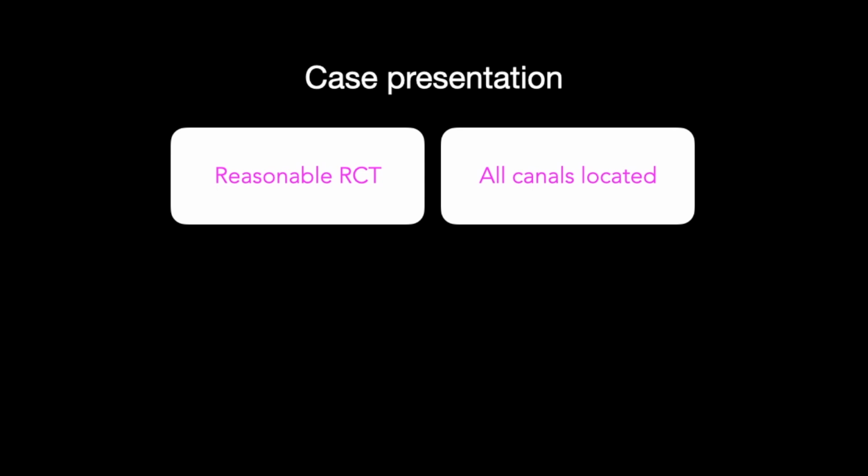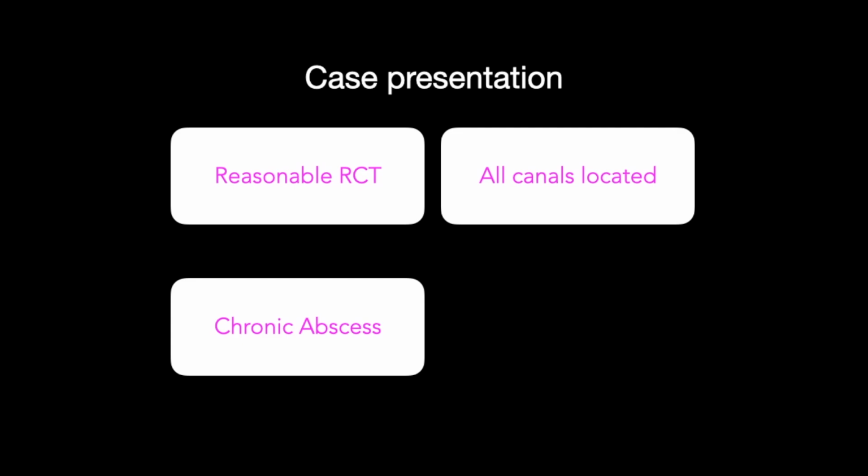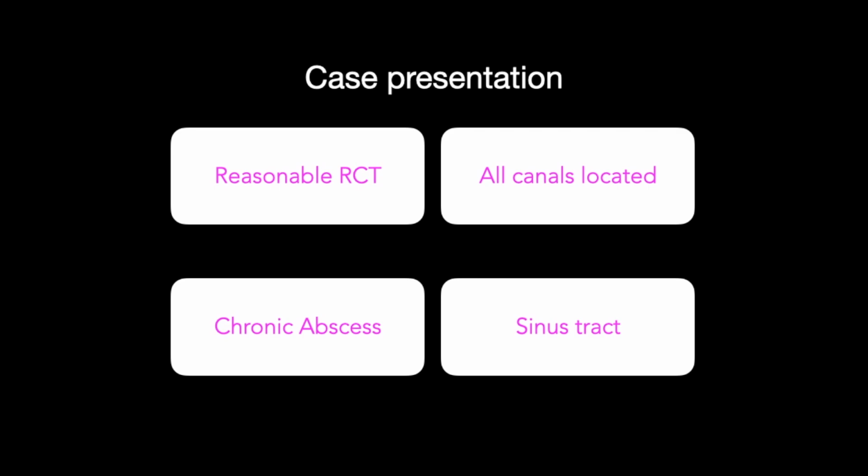case over two visits. The previous root filling was technically reasonable, and all the root canals had been located. There was a chronic abscess and signs of inflammatory resorption, and a sinus tract. A two-visit approach would allow me to see signs of early healing after cleaning and shaping.